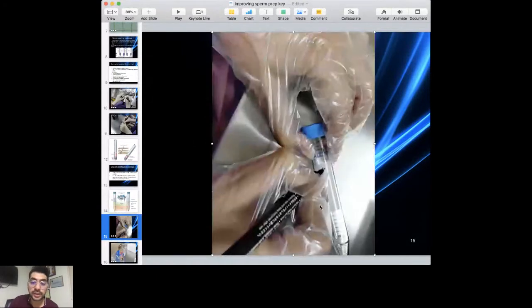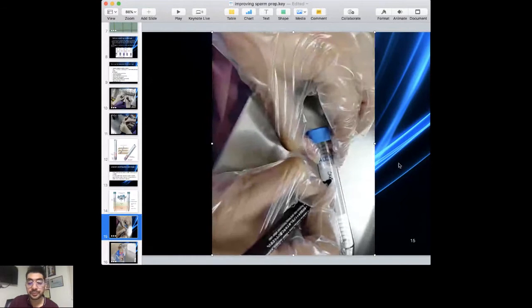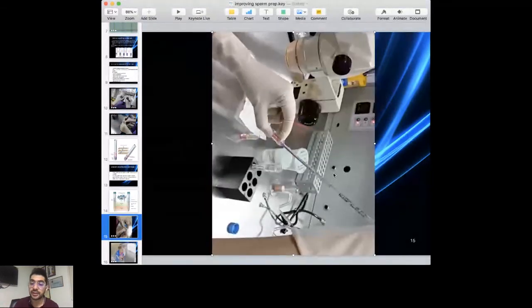Right. So if you noticed here, what we tried to do is, okay, so Paras, you have a question here. Can we underlay the 90%? Now, again, if you want to try and do that, you can do that because being heavier, the 90% density is going to stay below. But generally, to get even layers, it's easier when you overlay in such a scenario.